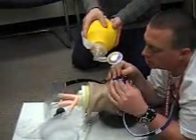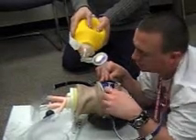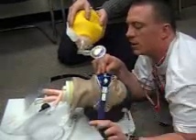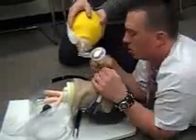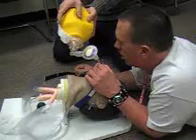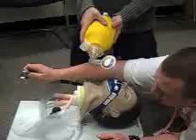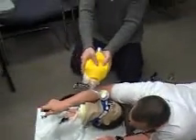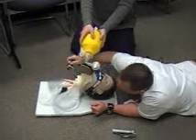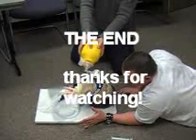Not letting go of the tube — we are still at 20 at the teeth. I've screwed my tube tightly down with the strap underneath the neck. I've now secured my tube so I can let it go. At this point I'm going to reassess breath sounds again, starting at the epigastric looking for absent sounds. Lower left present. Lower right present. Upper left present. Upper right present. Which means I continue to have proper placement, and I'm going to continue to bag my patient according to his needs.